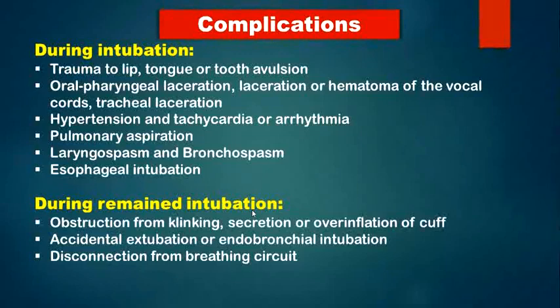Disconnection from the breathing circuit. The endotracheal tube is connected to the ventilator, so there may be disconnection. And of course, the patient will suffer complications, hypoxia and even apnea, if there is no spontaneous breathing. Pulmonary aspiration again can happen.